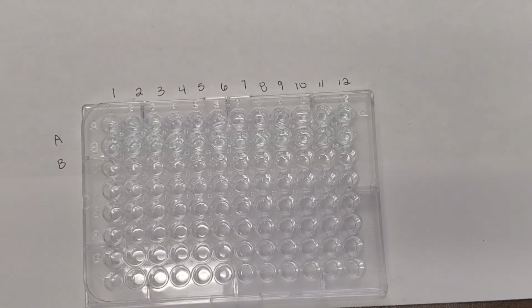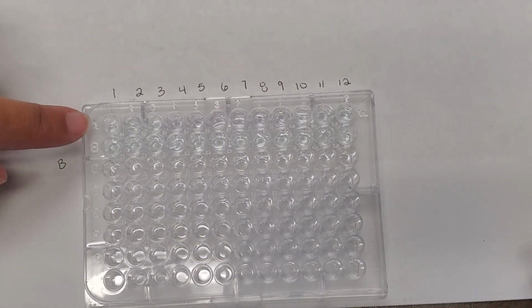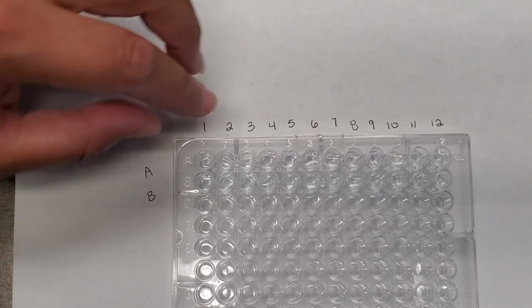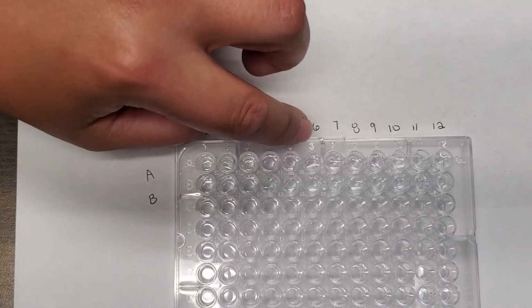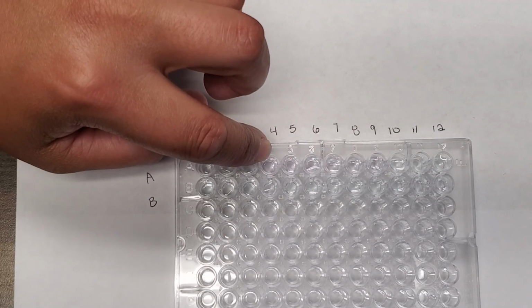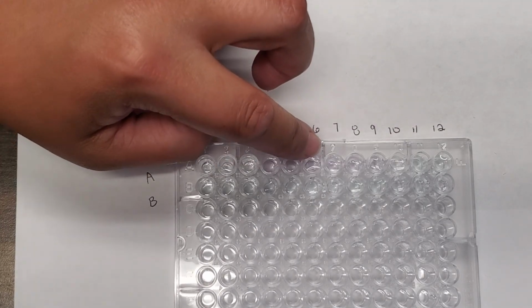So after we do all of that, we are going to sit and wait for the results. And so in this video, it looks like our negative control is actually a clearish color. It's almost got a green tint to it, where our positive control here, which is wells A4 through 6, is starting to turn purple. So the purple coloration indicates that we have a positive result and that the patient's serum does actually have the antibody in it.